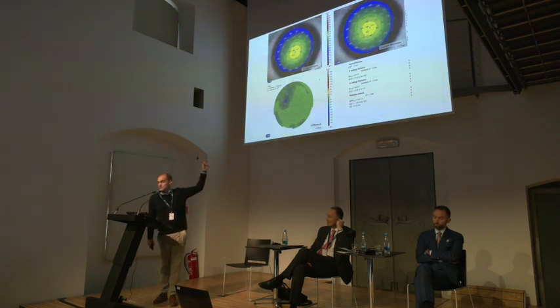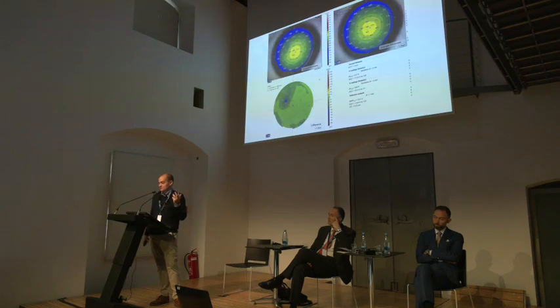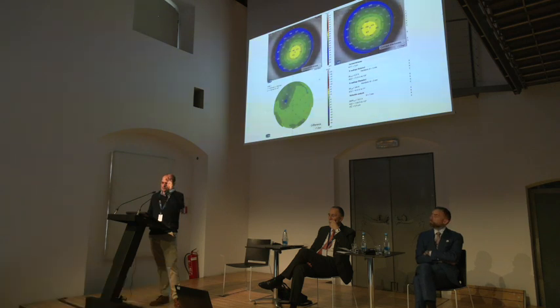Now, imagine doing that with Scheimpflug. First, it couldn't measure because you would get light scatter. Second, you couldn't track the same position because it's very difficult. And third, you could never get that beautiful view of showing the patient, okay, you see this is the epithelial cells they got in, we're removing them, and then you can show him the day after, look, we removed everything. It's such a great tool to have Phoenix in your office to show the patients what you're doing, how you're making the decision for them.